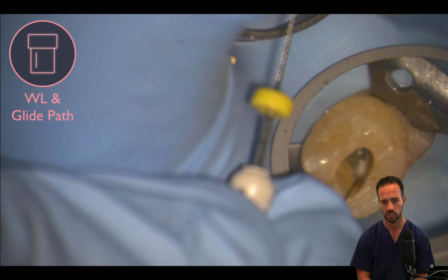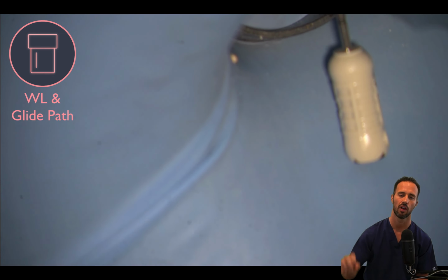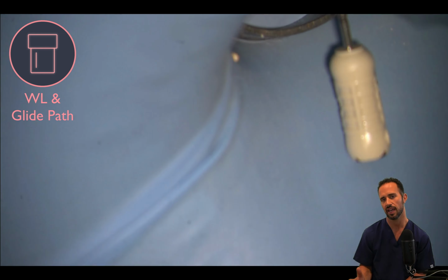But everything's starting to take shape. So now we're going to introduce all of our hand files, again, minimum size 15, in order to take our working length radiograph. These canals are already quite open, especially that palatal canal. And so, again, you can reach for the 15 files right away and seat them so that you can take your working length radiograph.